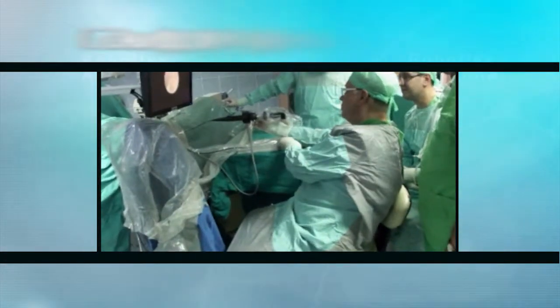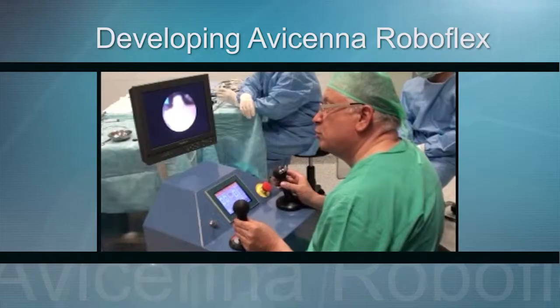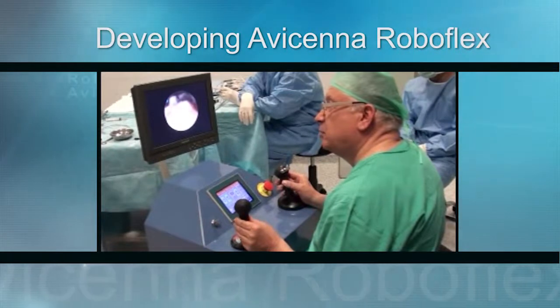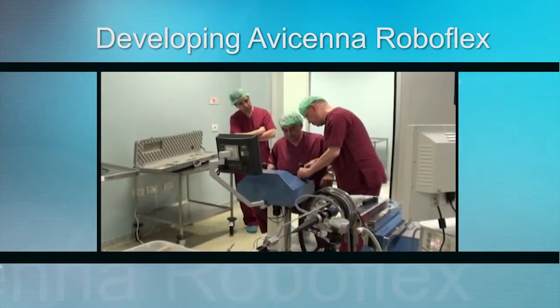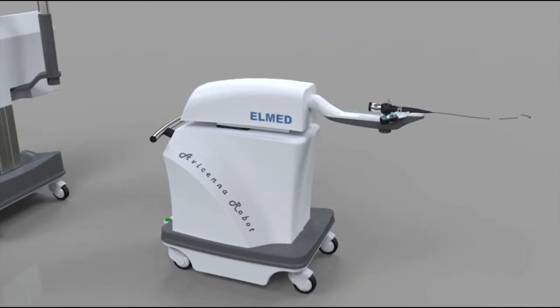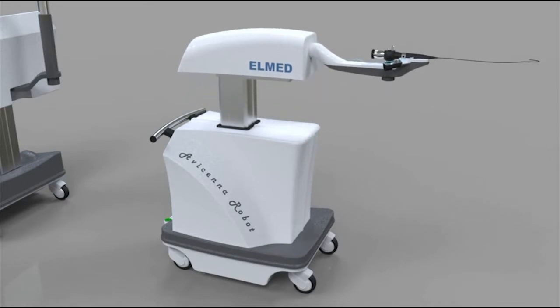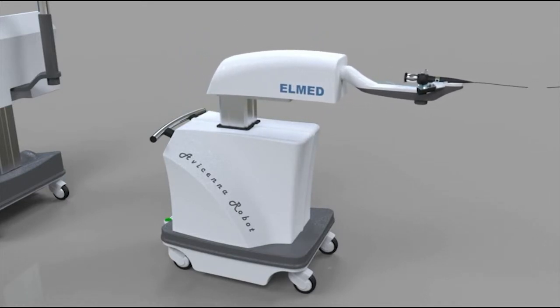It was necessary to design and then improve ergonomic platforms, not only to prevent fatigue for the endourologist, but also to reduce occupational hazards. The Turkish company, Elmed, designed and developed a new robotic manipulator to remotely control all of the functions of the flexible ureteroscope.